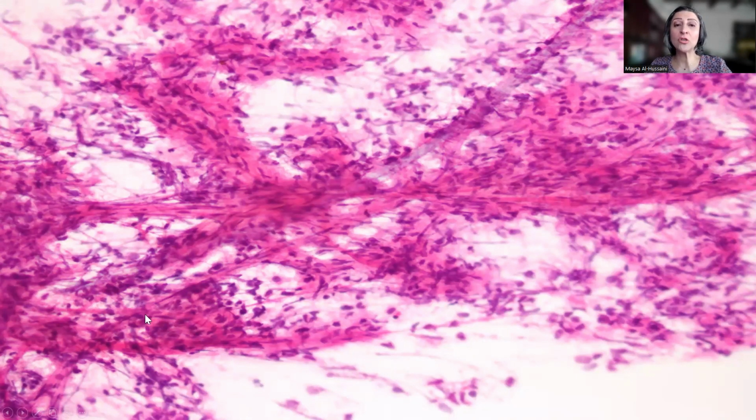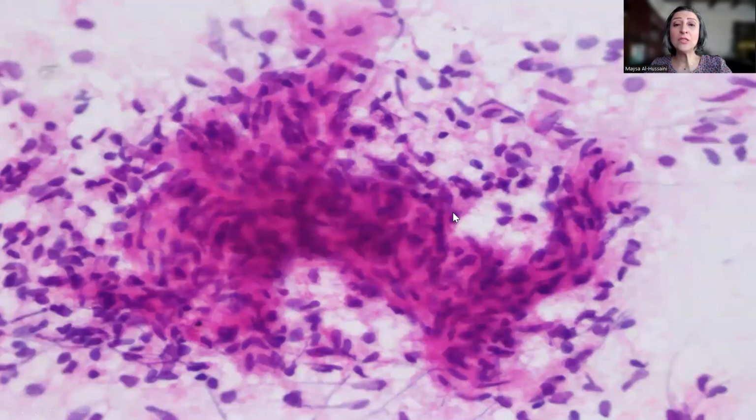Now, other areas, however, showed really high vascularity with the blood vessels traveling in all directions, reminiscent of transecting roads, highways, actually. And this should bring into the differential diagnosis vascular tumors, something like the solitary fibrous tumor or hemangiopericytoma. And please pay attention to this very peculiar appearance or shape of the vessel.